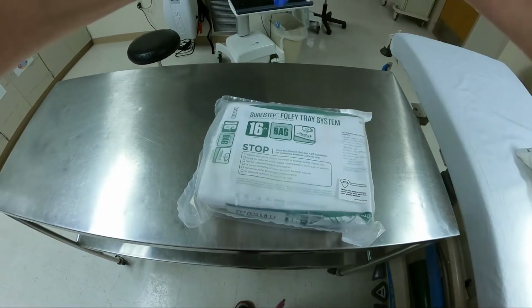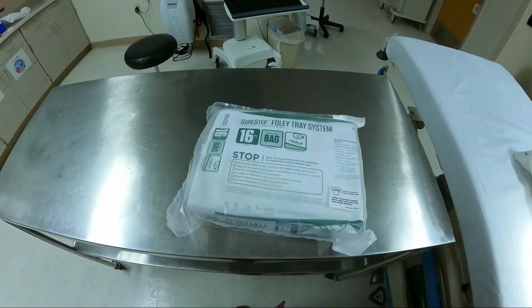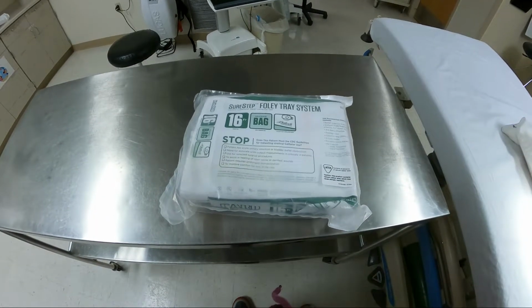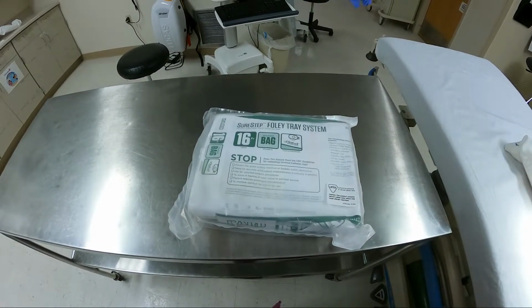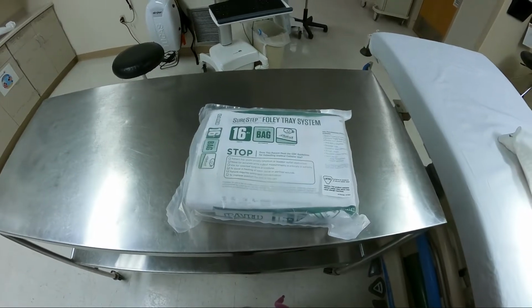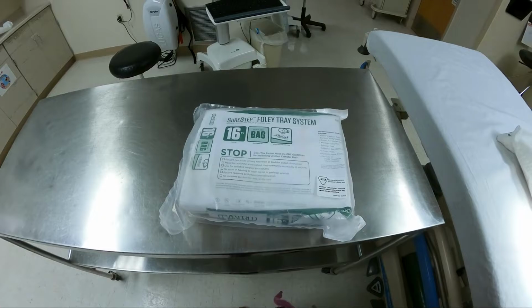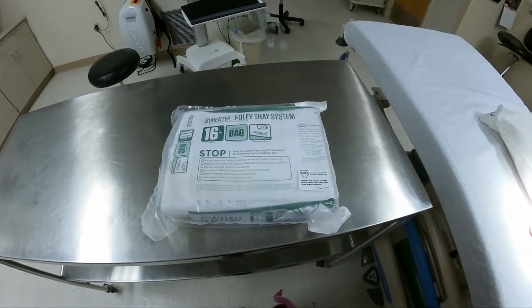Then you're going to disrobe the patient. I usually try to give them a sheet to put over their thighs or their abdomen so that we can keep them as covered as possible. But it's important that they don't pull the stuff back over them, because if you clean them and you have to reach up to grab a cover, you're recontaminating yourself.